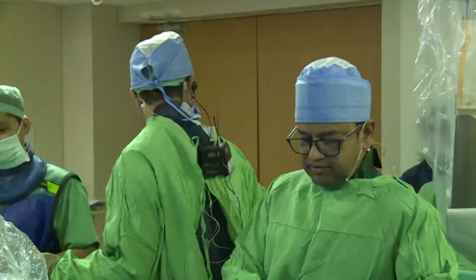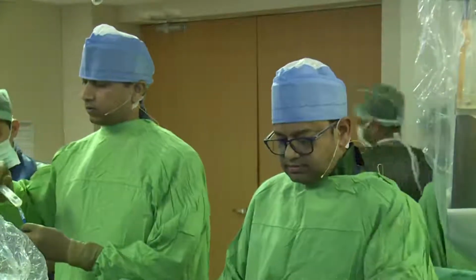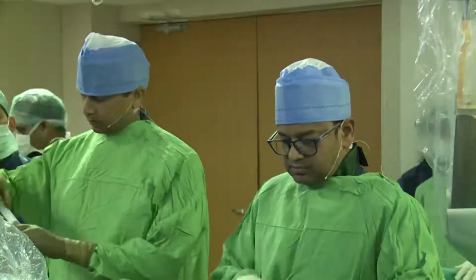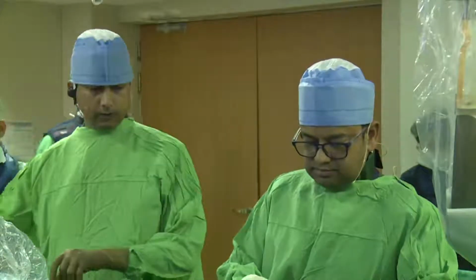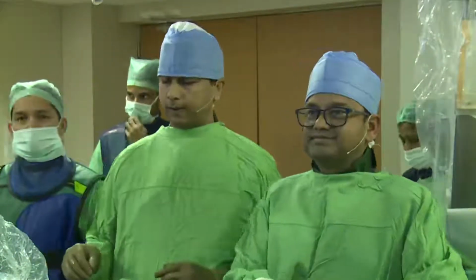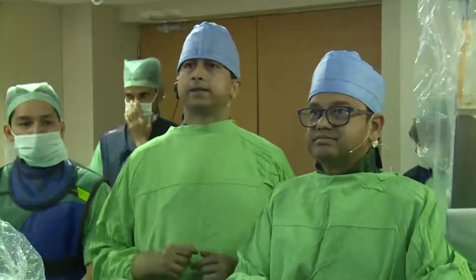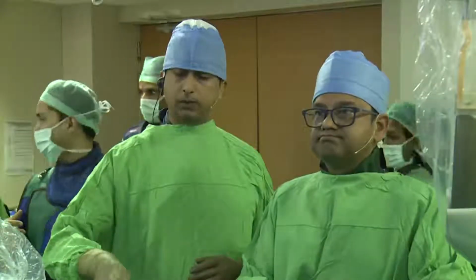So the proximal end will dilate with 3.5 and then take a final shot. Yes, sir, post-dilatation. You can see you were not happy with the feeling with the wire on the proximal end of the stent. Yeah, so I think once we had difficulty in the proximal end, it's better that we end up with a post-dilatation.